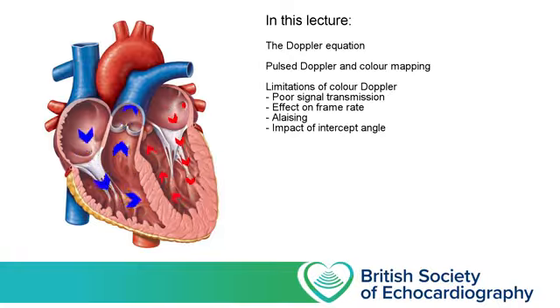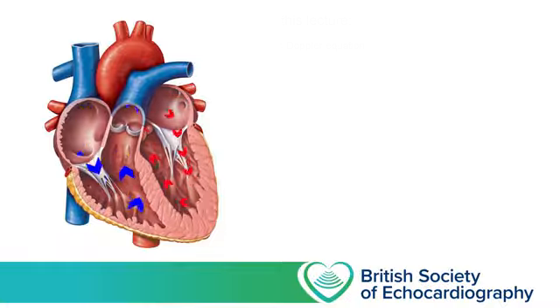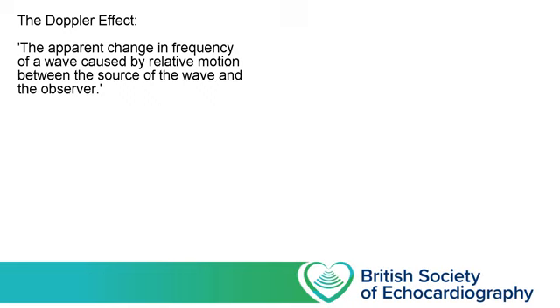This lecture is necessarily quite physics heavy, and as I say, if you don't understand all of the concepts that are described at first watch, that shouldn't be a barrier to you getting out and using this technique. And you can always return to this lecture once you've had a bit more experience imaging heart valves. Alright, so let's begin with some physics.